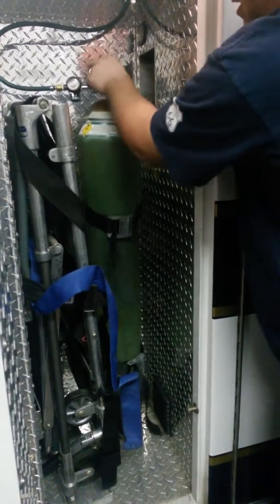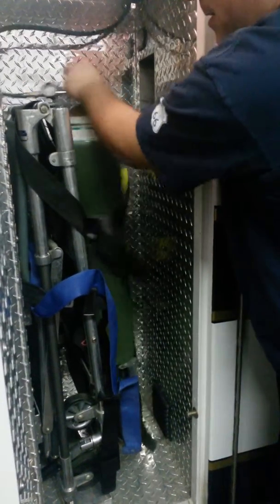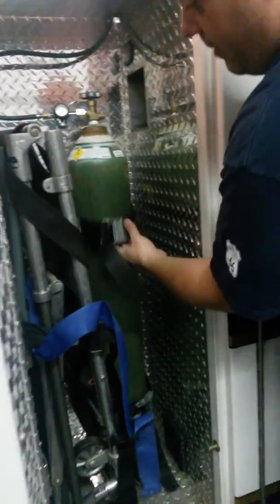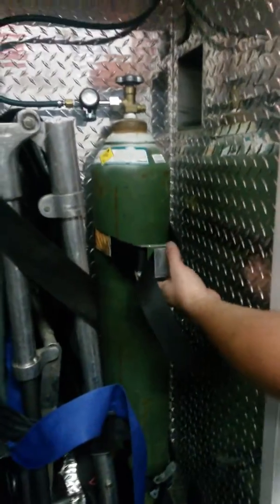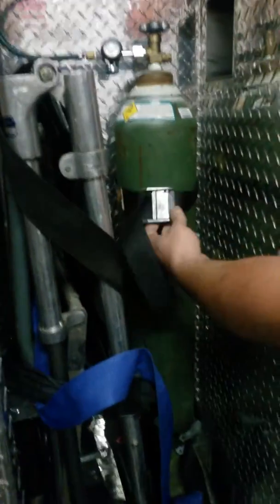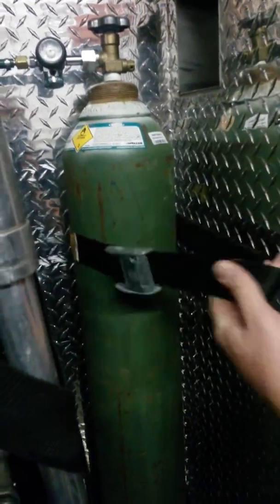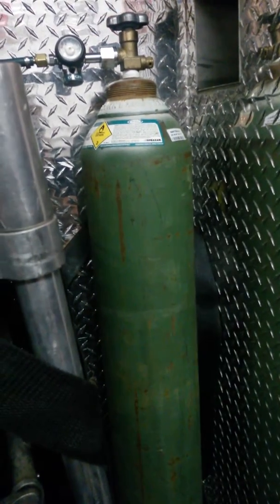This bottle is not secure because whoever put it in didn't fasten the straps correctly. And every time that there's any load put on this, the strap comes undone.